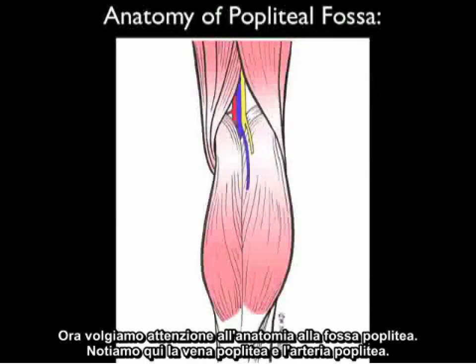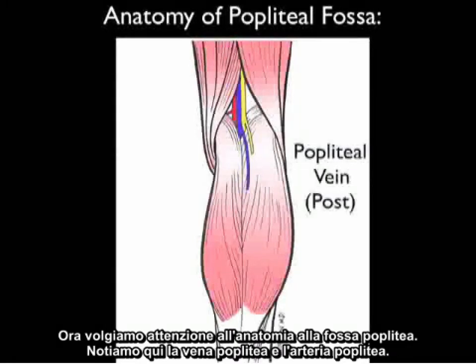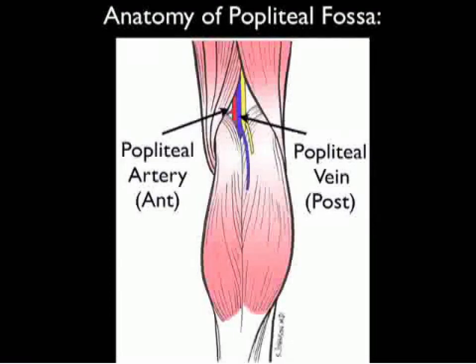Now let's turn our attention to the anatomy of the popliteal fossa. We note here the popliteal vein and the popliteal artery. Remember that the popliteal vein is going to be in an orientation located more posterior to the popliteal artery, which will be located more anterior.